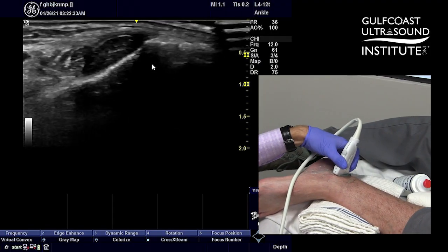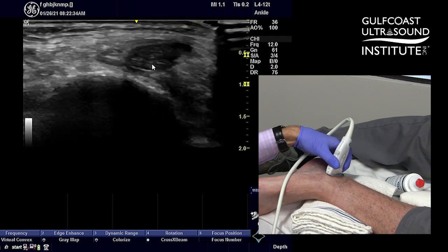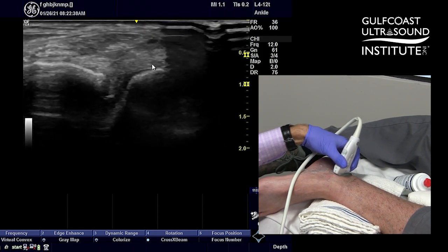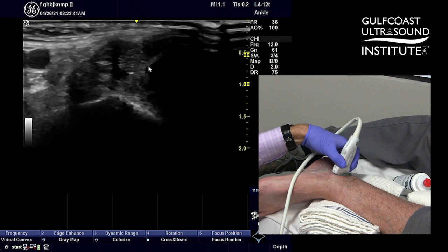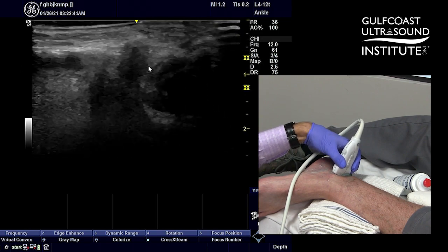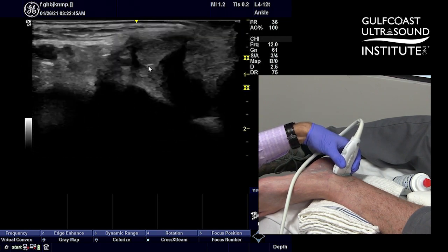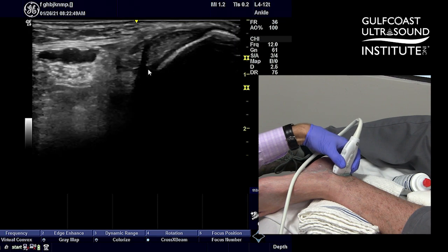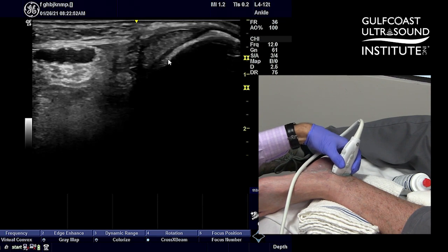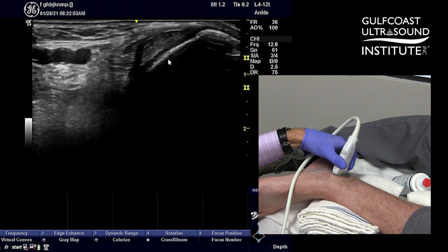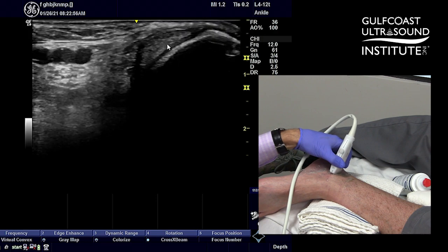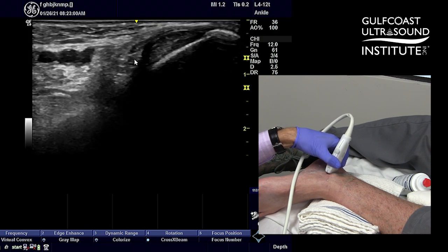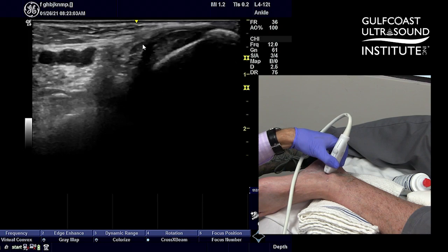I'm going to start with a short axis view of the posterior tibialis, and as we scan inferiorly you can see a little bit of anisotropy here, but we're focusing mostly on the posterior tibialis demonstrated just above the arrow. You have the bony acoustic landmark of the medial malleolus with the posterior tibialis in short axis, flexor digitorum longus, which is about half the size, and then the neurovascular structures.